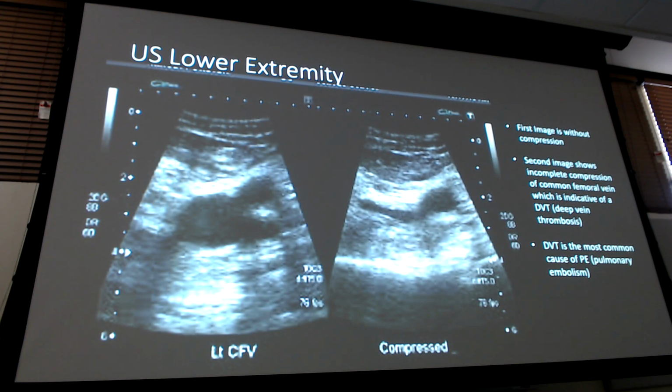Yeah. I was curious, for this procedure, are you just running it down there like that? So a lot of times the ultrasound tech will do this one, right? It's a specialized type of test. Maybe if you guys get really adept at using the ultrasound, you might be able to, but a lot of times this is ordered by the ultrasound tech, okay? And so they know where the main veins are going to be in the calf, and they're just scanning and compressing, and they'll go down a little bit and compress, and go down a little bit and compress, right?